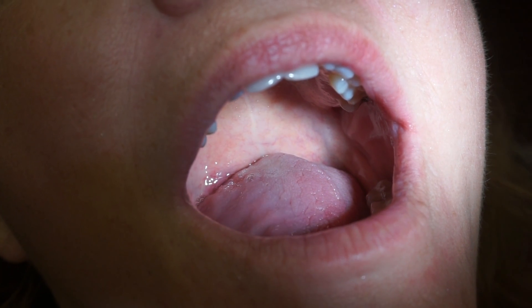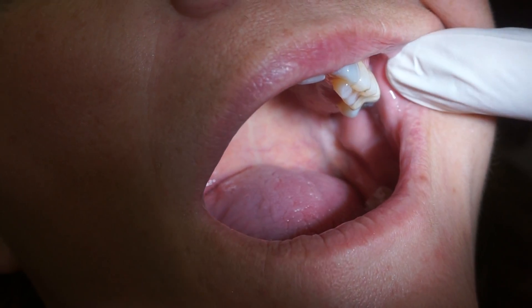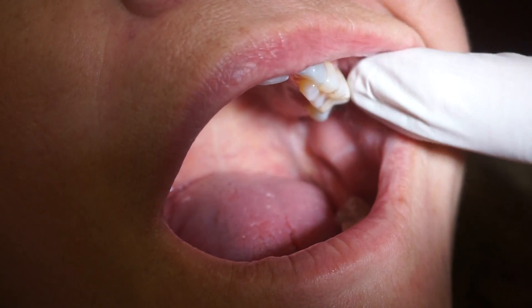We're going to be using the implant test on an implant that had an internal sinus lift several months back, and it's been restored and in the mouth for a little while now.